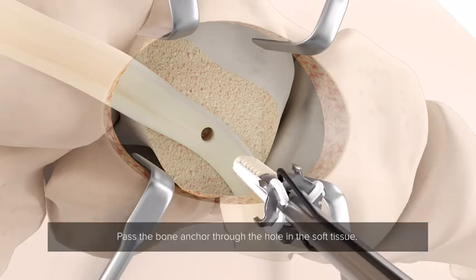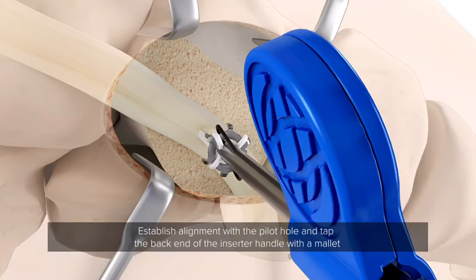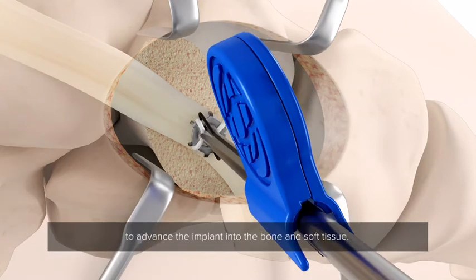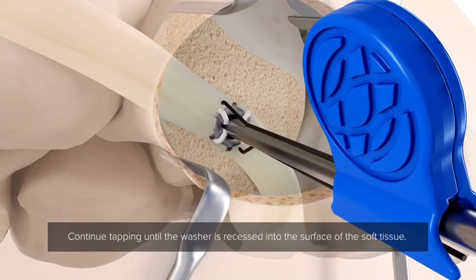Pass the bone anchor through the hole in the soft tissue. Register the distal tip of the bone anchor to the pilot hole in the bone. Establish alignment with the pilot hole and tap the back end of the inserter handle with a small mallet to advance the implant into the bone and soft tissue. Continue tapping until the washer is recessed to the surface of the soft tissue.